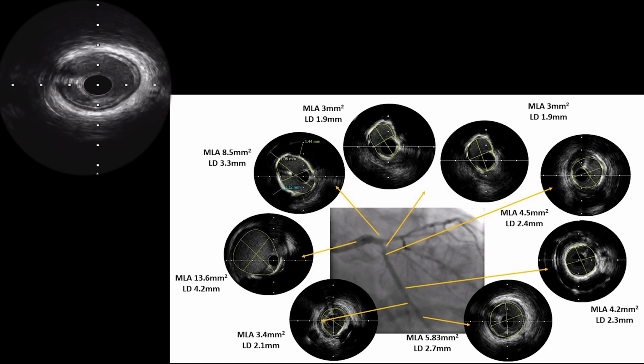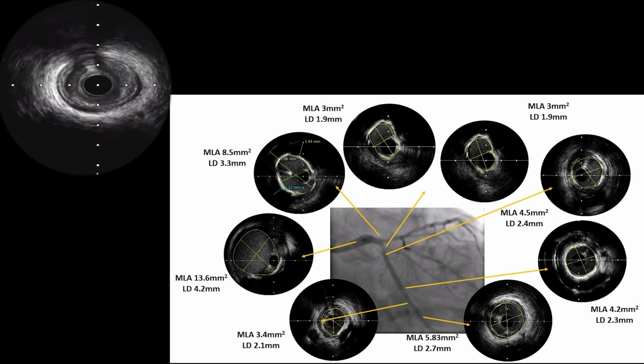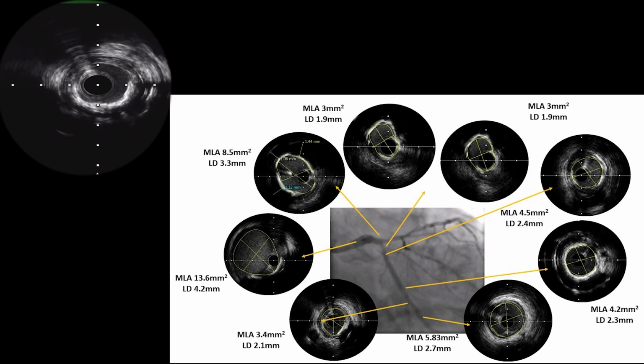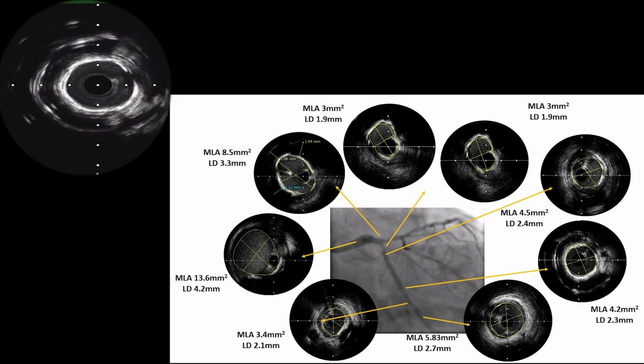You can see the trilayer structure, you can see luminal area very good. There is no significant plaque burden. This is from the distal LCX. We are able to see borders very clearly, very good IVUS images. You can see the trilayer, no plaque burden distally. See trilayer structure, no plaque, and we are coming proximally. Here some plaque is appearing. You can see the small branch, some calcium is there. You can see the eccentric calcium, almost 270 degree, thick calcium, luminal area diameter is only 2 mm.